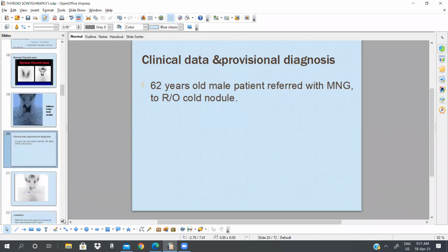This is very important. Sometimes ultrasound will show you nodules so small, less than 1 centimeter in diameter, let's say 4, 5, 6, 7 millimeters. These nodules usually will not be detected by nuclear medicine. The importance is for nodules which are more than 1 centimeter. They have clinical importance. Less than that, it's clinically insignificant.